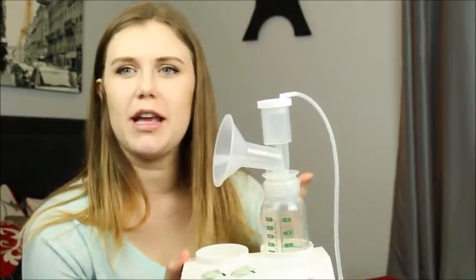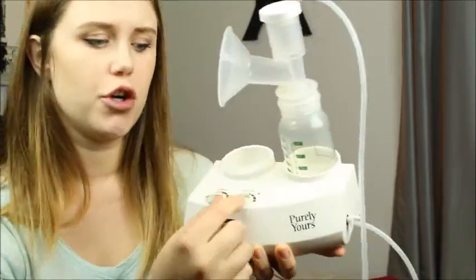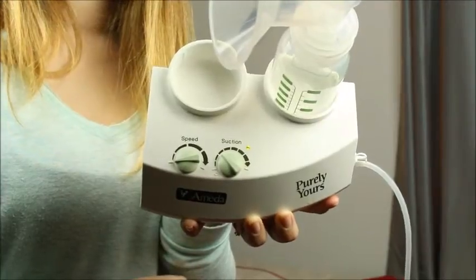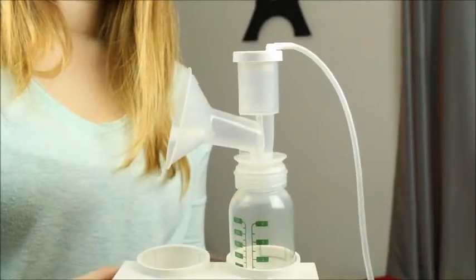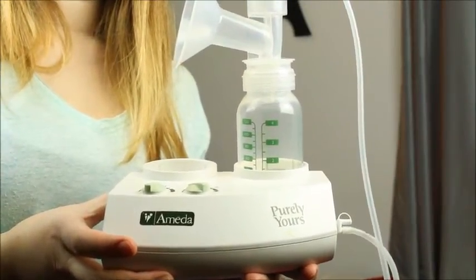In the beginning, I will say it was a little tough figuring out exactly how I wanted to pump. I didn't have that much milk in the beginning, but you get the hang of it so fast, it's not even an issue. So the way you would turn it on, there is a suction knob. That's the one you turn on. So to turn it on, turn on the suction knob, and you can hear it. It's going fairly slow. And that is how it works.